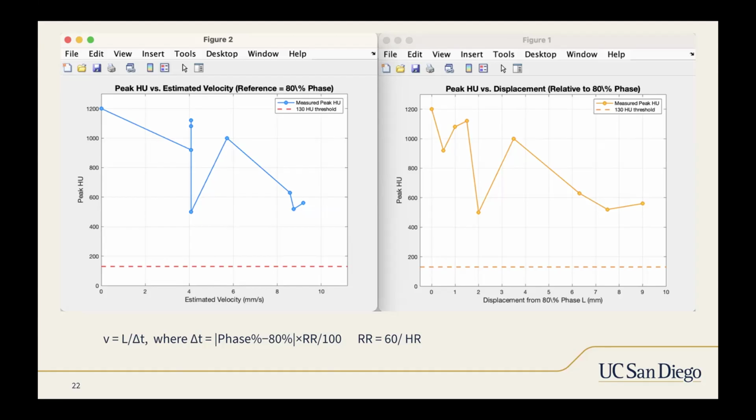We were also looking at how there could be partial volume effects. Whenever a small lesion straddles two or more voxels, each reconstructed voxel can see a mixture of calcium or soft tissue, and so its peak amplitude is dragged down.